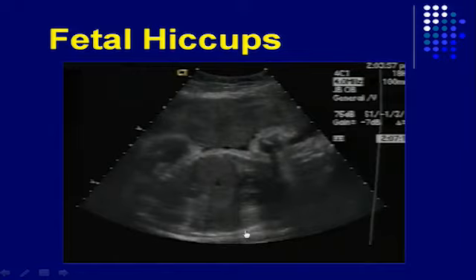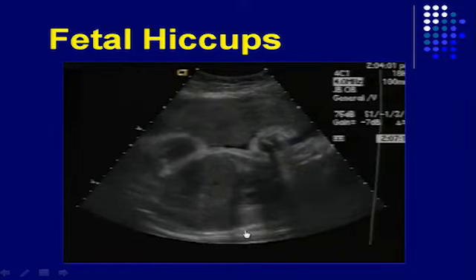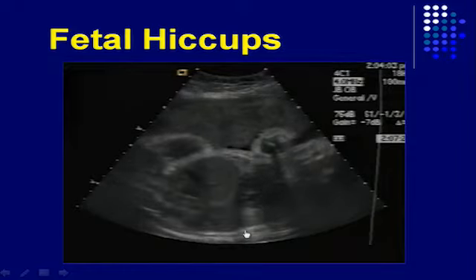These are hiccups. So see how there's a difference? And a lot of times mom will tell you, oh, baby's doing hiccups. I mean, they can feel them.